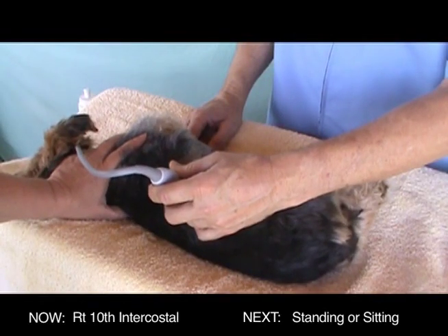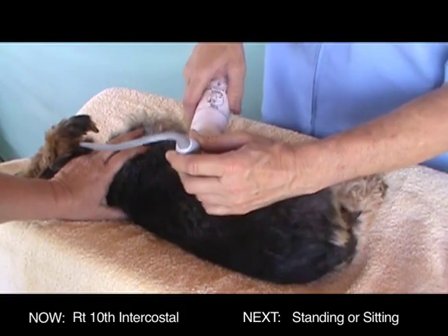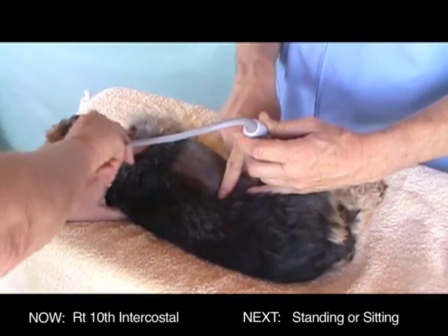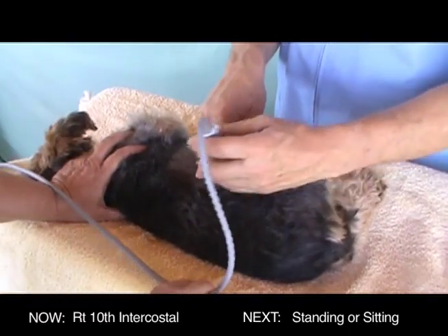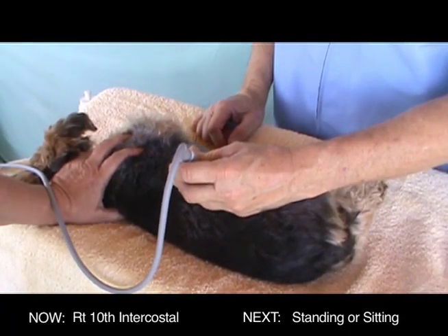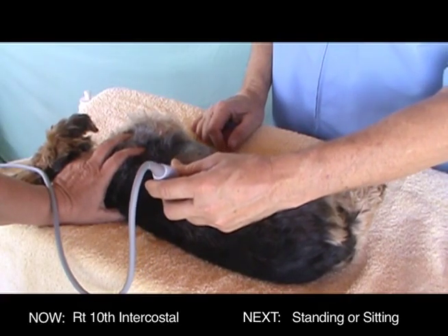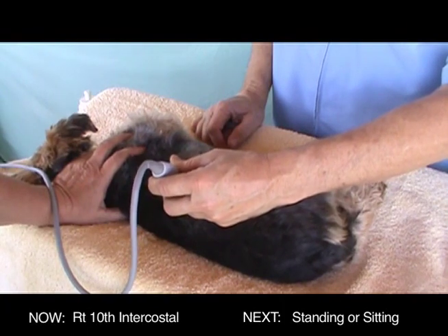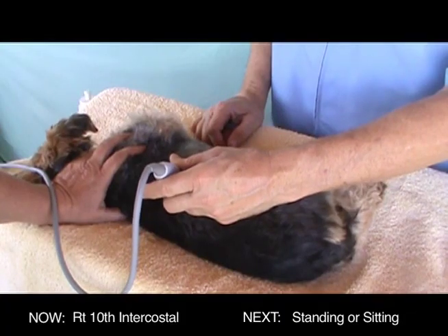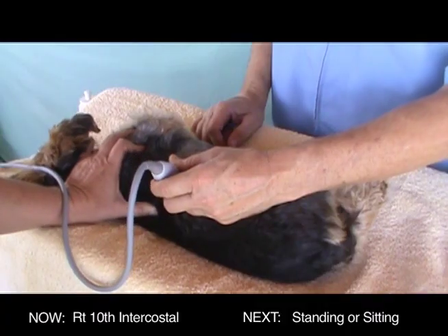The right 10th intercostal view is used mainly in large or deep-chested dogs to view right cranial abdominal structures such as the portal hilus, aorta, caudal vena cava, gallbladder, and common bile duct. A right lateral intercostal approach from the last 3 or 4 intercostal spaces is used, and transducer pressure must be applied to collapse the lungs. The patient can be in dorsal or left lateral recumbency.